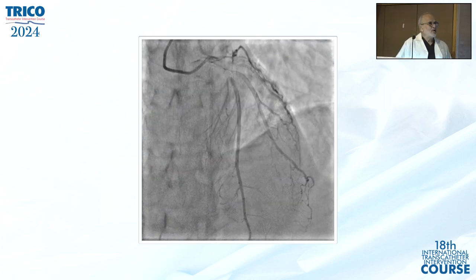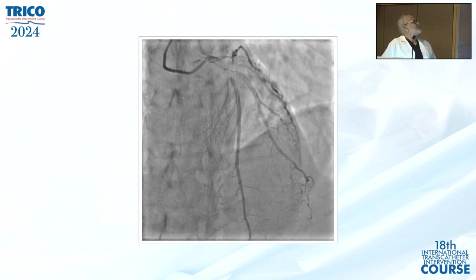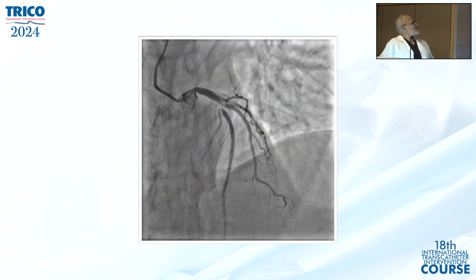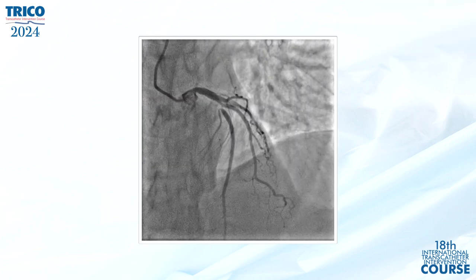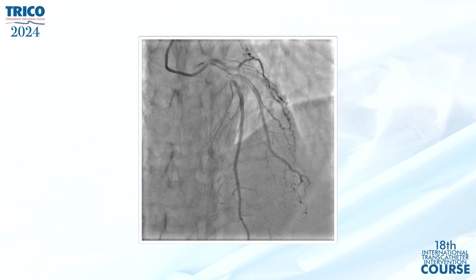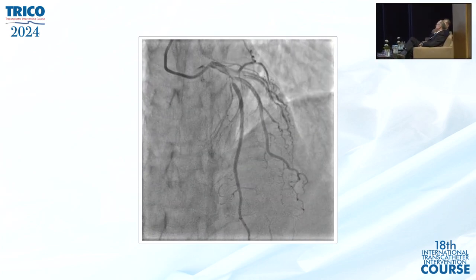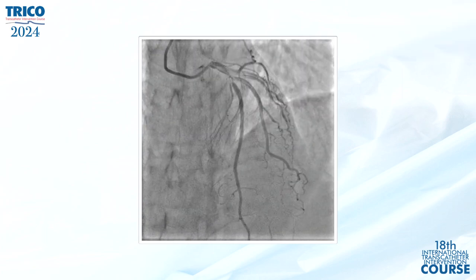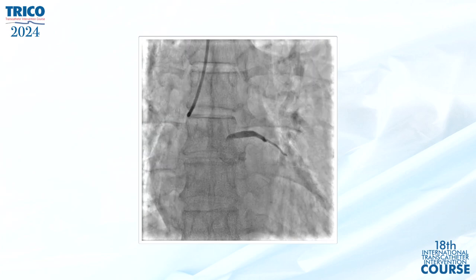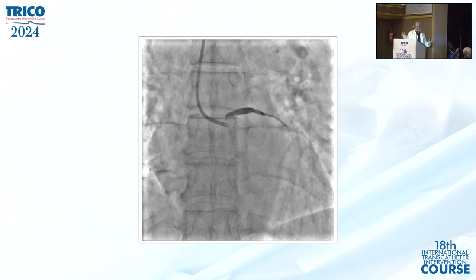And wow, you think that it's a good case for mini crush, Samir? Yes. Yeah, it is. Right? Yep, it should work. We also thought so. It was 7 o'clock in the evening after an exhaustive list of 25 procedures, including 7, 8 or 9 interventions, me and Sanjay, the first guide catheter shot, and this was the picture.